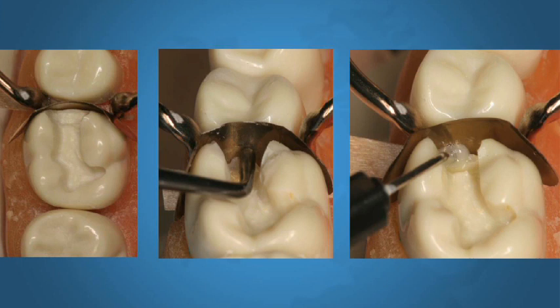This would have been a situation where I remove an old amalgam, and basically I'm left with a traditional GV Black preparation. If you see the middle photograph, you will see me with a rounded instrument, burnishing the matrix band. I cannot understate how important it is, every time after you place your matrix band, you have to burnish the matrix against the adjacent tooth.